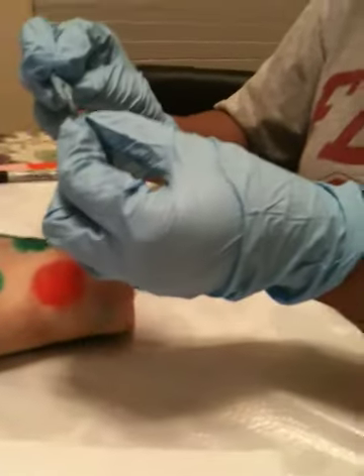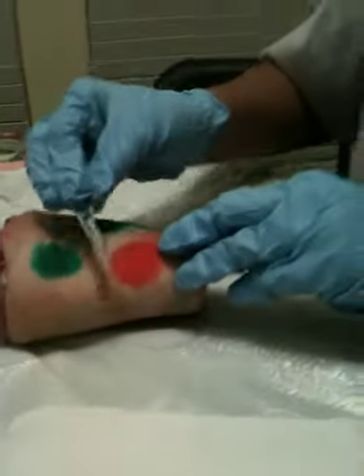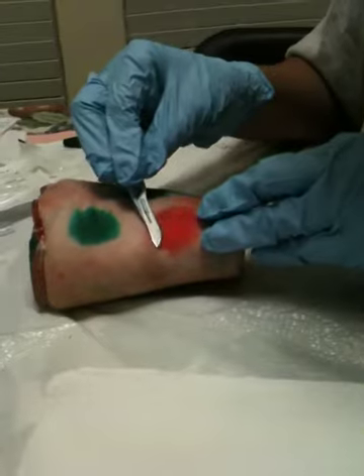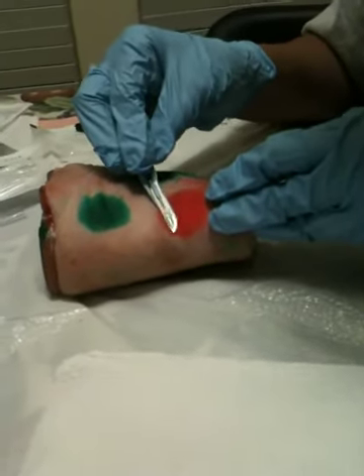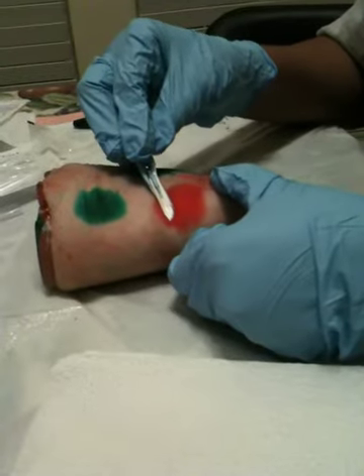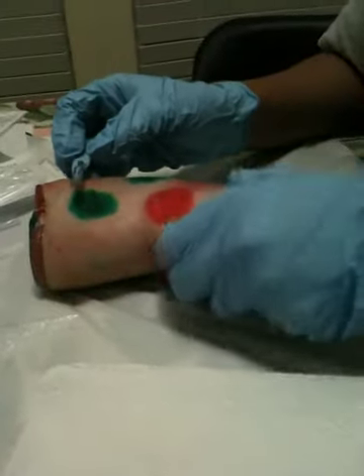Here's another fleck. Just see the dye running a little bit lighter, but I'm definitely going to look out for a white area which would indicate viable tissue.